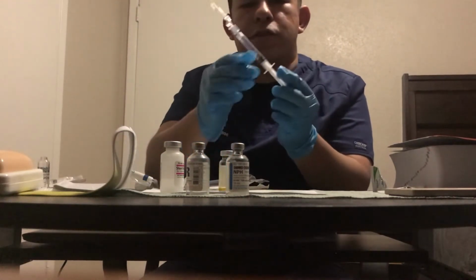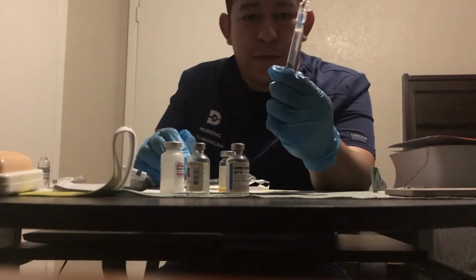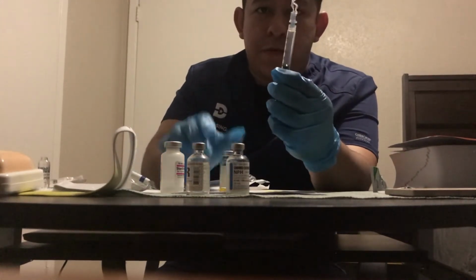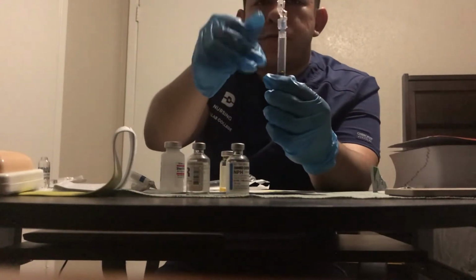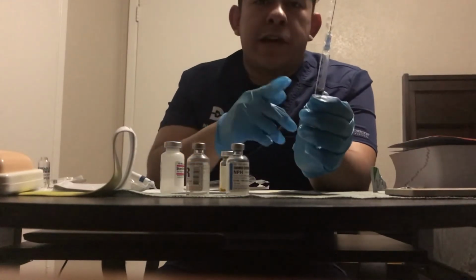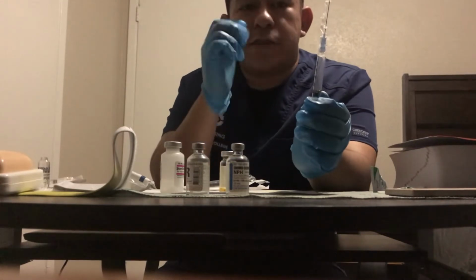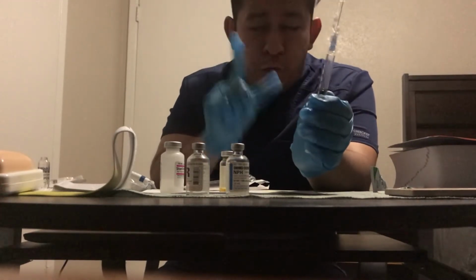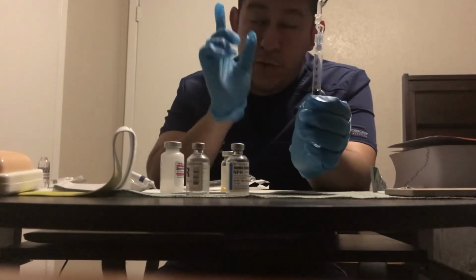So then we have our 2.5 mLs of ceftriaxone. And of course, you would immediately put the safety on or put the cap on and dispose of the needle because it is imperative that when you give this to the patient, you have to give it to them using a fresh needle, not the needle you prepared it with, but a fresh new needle.